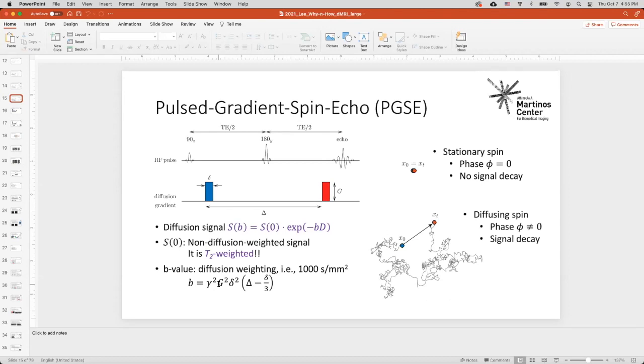There's another question about the image processing pipelines you discussed. Are these processing pipelines designed specifically for brain imaging, or can they be used for more general purposes, say for body imaging?